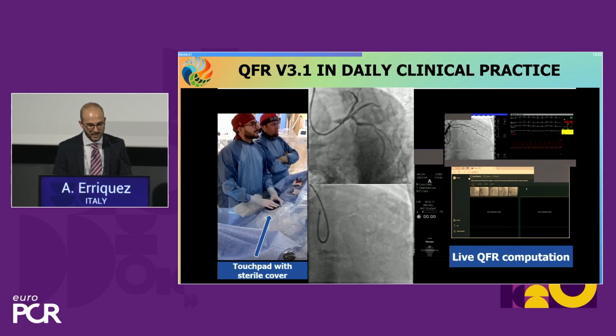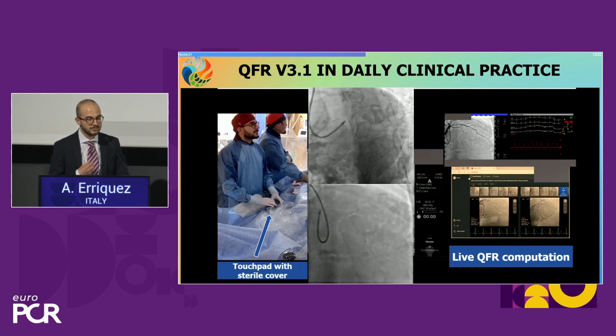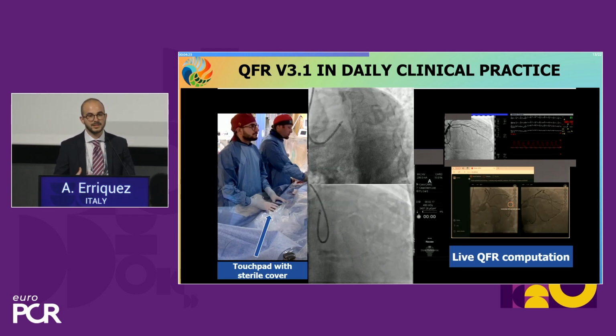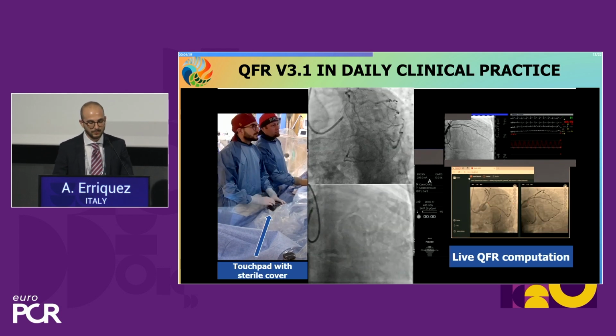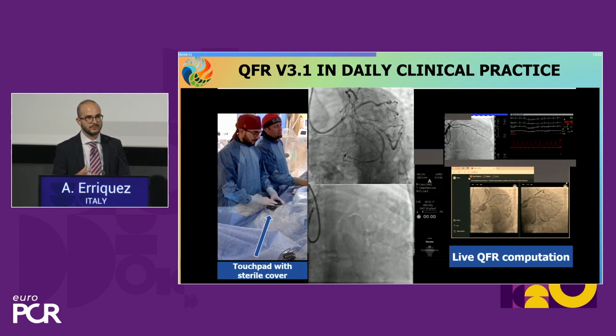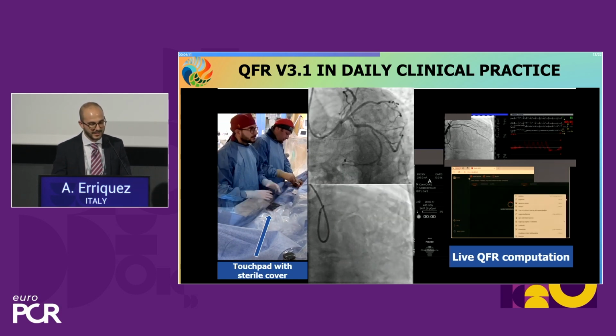Lastly, for QFR, I want to show you how the 3.1 version of the software can be easily used in daily clinical practice for live QFR computation inside the cath lab, without the need for other operators outside the cath lab to perform the analysis.